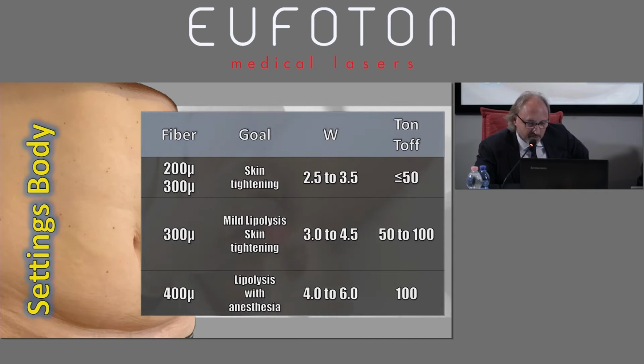The colleague working with me in my office, Domenico Romano, whom you already met, really loves the 200 fiber for the knee. Even though it tries to get out of your hand with the low energy emission, this fiber is very effective and performs very well. So we absolutely suggest using this fiber.